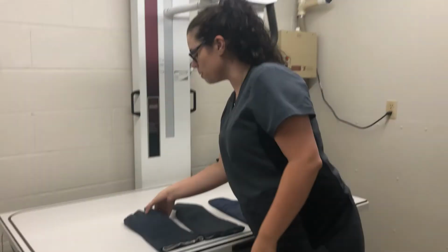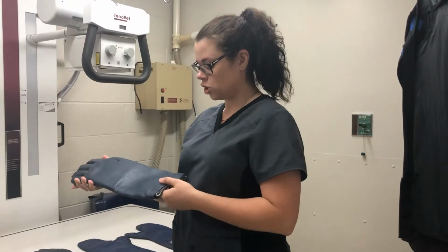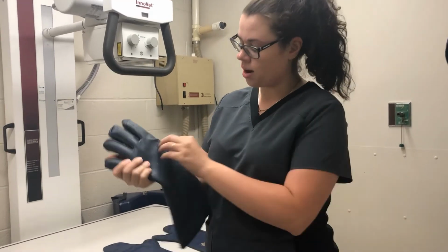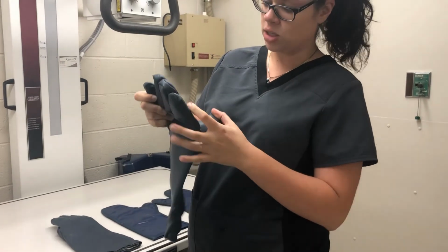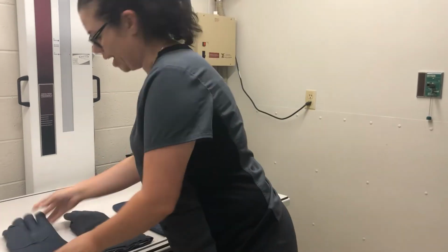Very good. All right, we are going to evaluate our PPE for our X-ray machines. We want to make sure that we don't have any cracks or any heavy wear and tear on this. This has some minimal wear and tear on the outer layer here, not on the lid. On the outer layer, we've got some breaks in here. They've been bitten a few times, you can see, but otherwise they're intact.